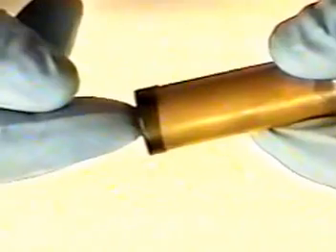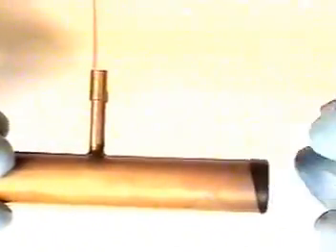Be sure the bending rubber sheath is pulled up and around the end of your vacuum jig. Proceed to the other side. Cut off XX once you stretch the bending rubber, and again pull the sheath up and over the other end of the vacuum jig. The bending rubber is now fit into the jig and ready to apply onto the endoscope.